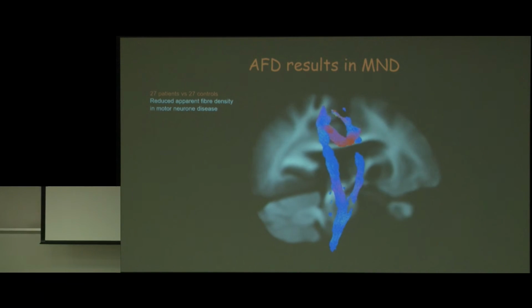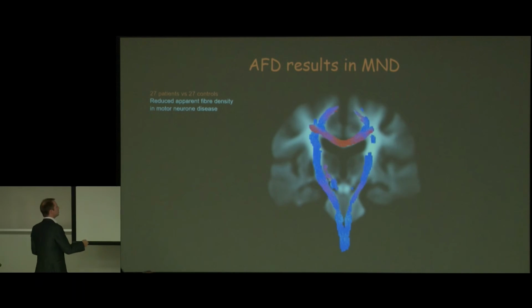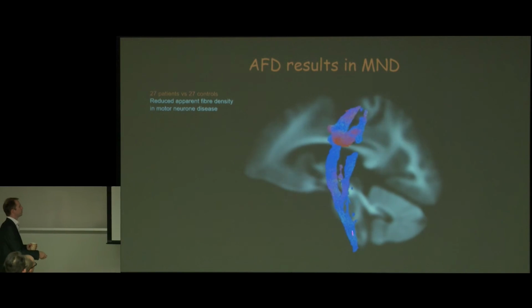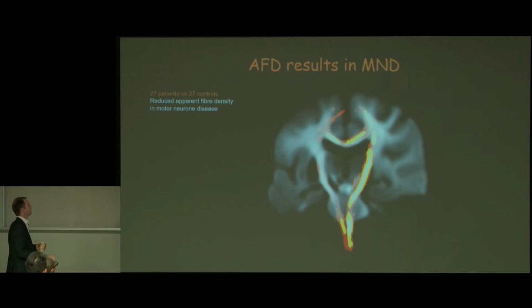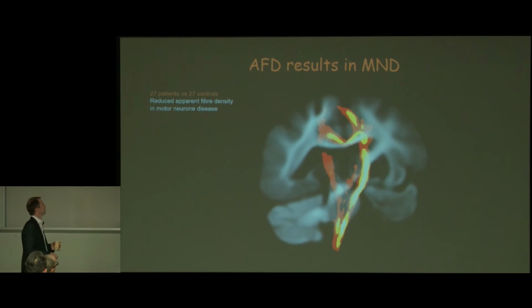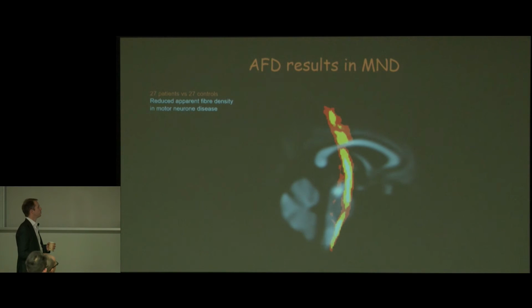Okay. So it's showing basically the areas that I highlighted before, corpus callosum joining the motor cortices, and then both cortical spinal tracts all the way down. You can see this interruption that I was talking about. You still get enhancement even though you have an interruption in the t-values. And that's color-coded by the t-value as well. So we're basically pulling out exactly what we expected to see in this data.